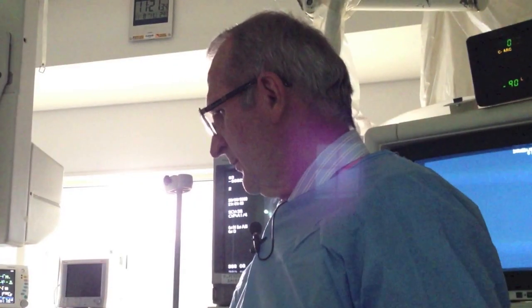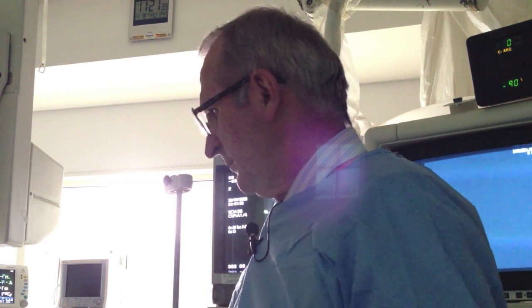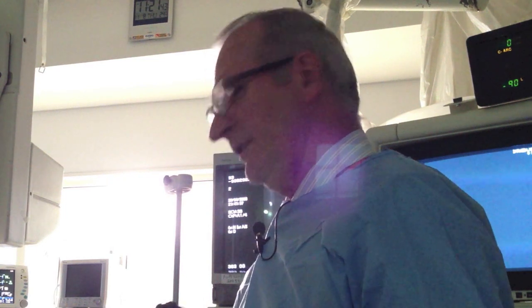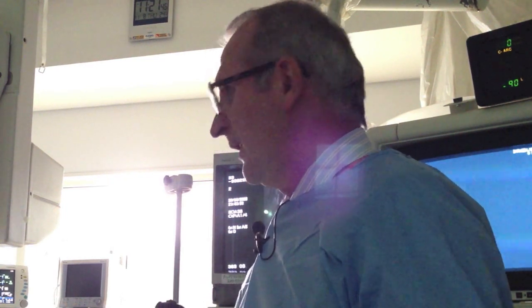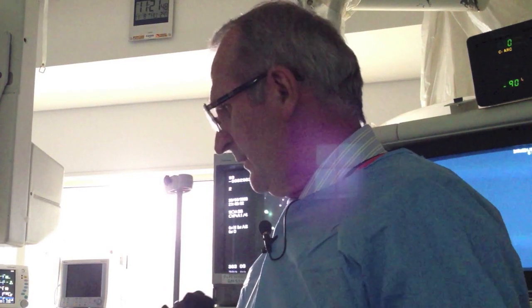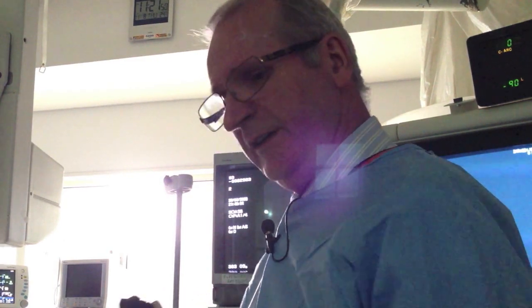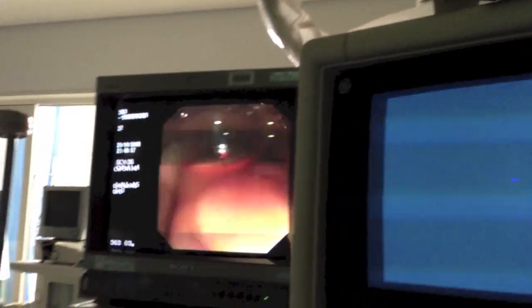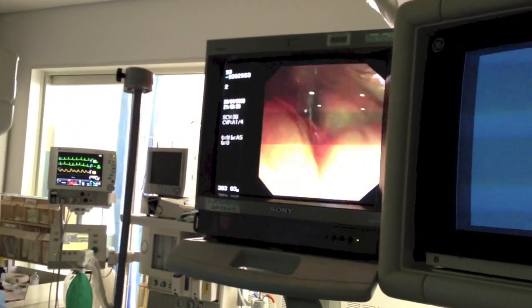I am going to start the procedure. The patient is now in the supine position. This is not a regular position, but in certain situations we have to put the patient in the supine position because they are a high-risk patient under anesthetist surveillance and sedation. Now I am going to insert the scope into the mouth of the patient. The scope is now inserted into the esophagus, now I am going to the stomach, and now I am in the second part of the duodenum.